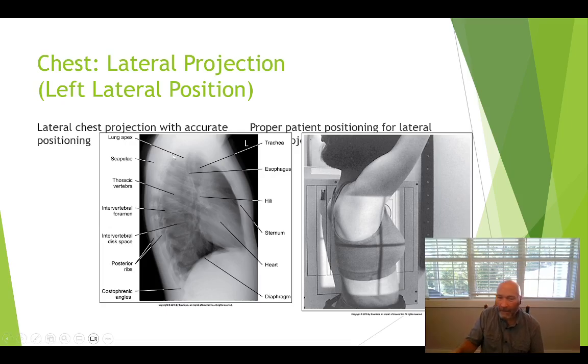We might do a little bit of tweaking to our chest X-ray and our positioning of our central ray and also of our image receptor.